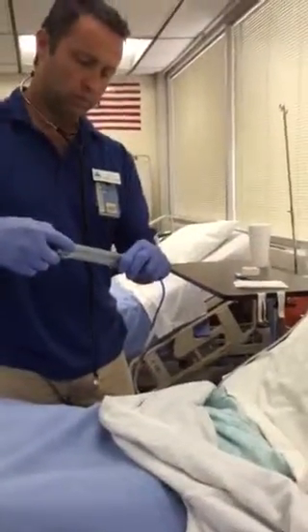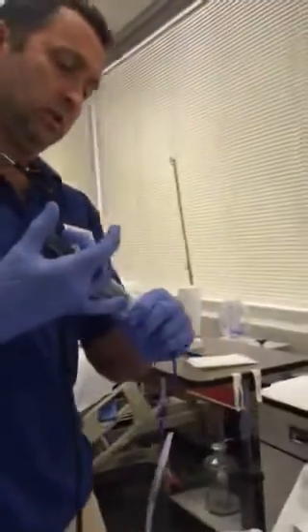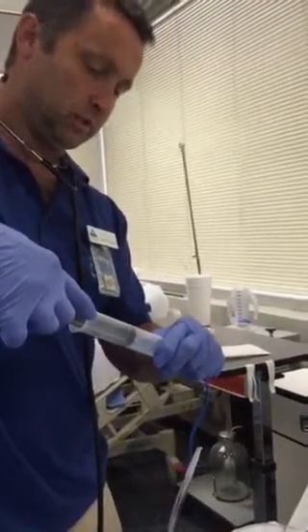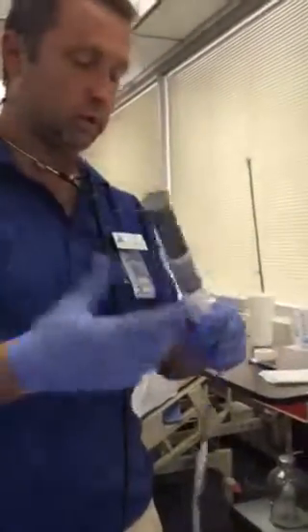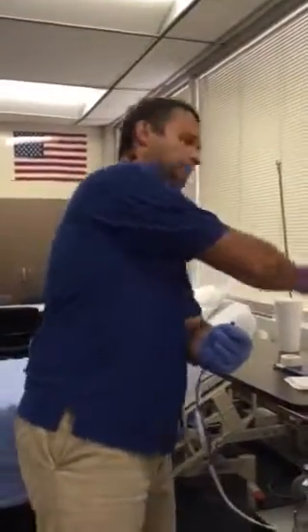I'm going to withdraw. What I'm looking for, I want 30 milliliters back. If I don't get all 30 milliliters, I can reintroduce, try it again, pull back until I get 30 milliliters. And look at that, we successfully got our 30 milliliters back, and a little bit more, a little bit of stomach contents, and now we're just getting air. So we will disconnect.